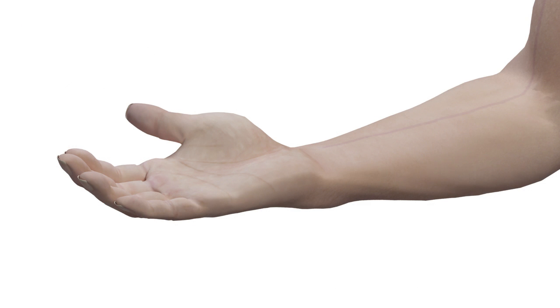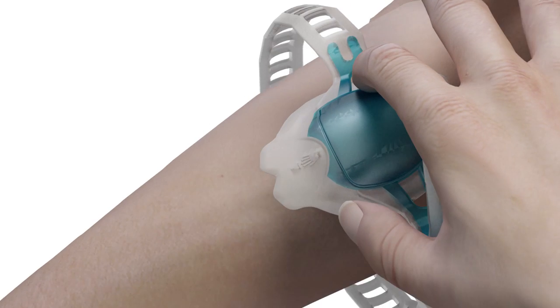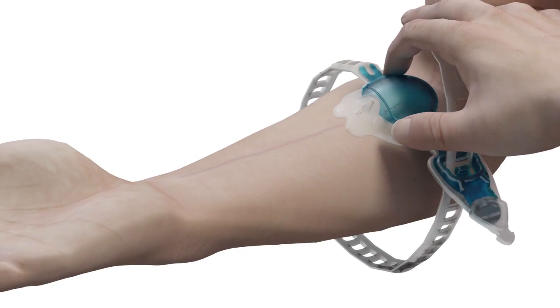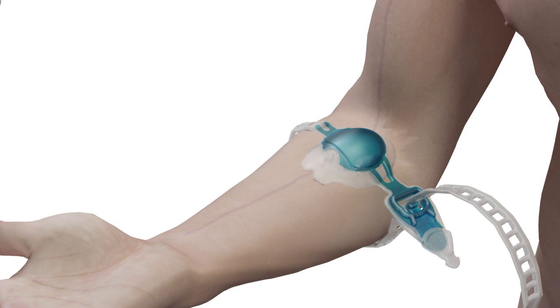First, inspect the limb carefully to identify a suitable vein for cannulation. Then apply the tourniquet, aligning the V section of the vacuoderm above the selected vein, pointing away from the heart. Tighten the tourniquet to achieve vein occlusion.